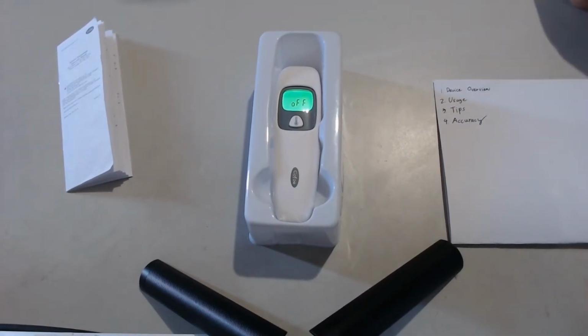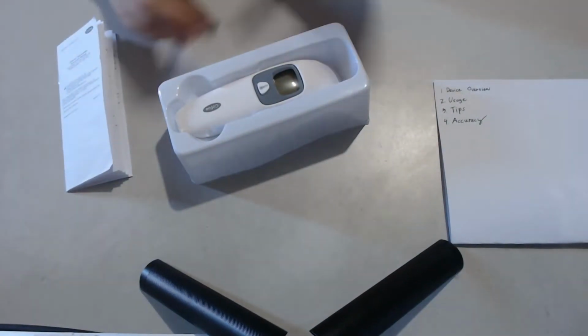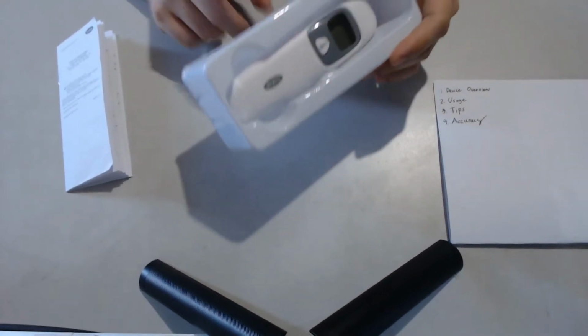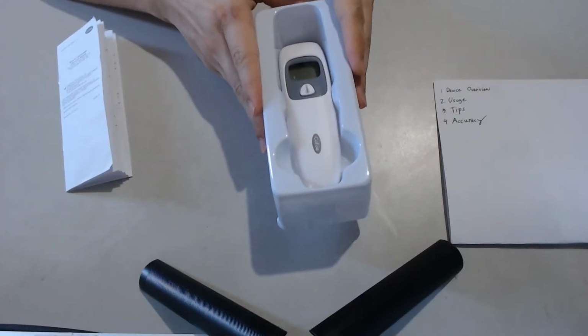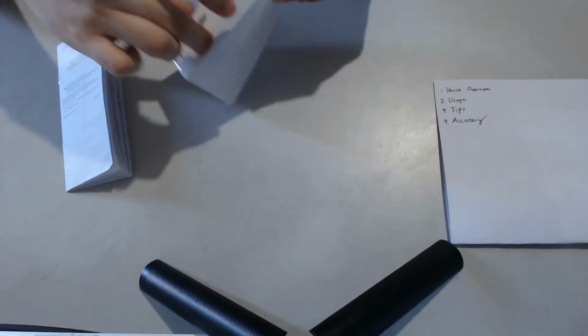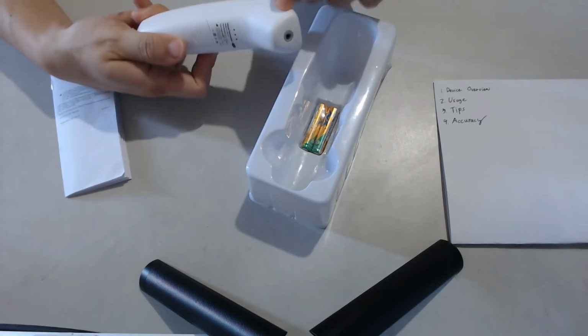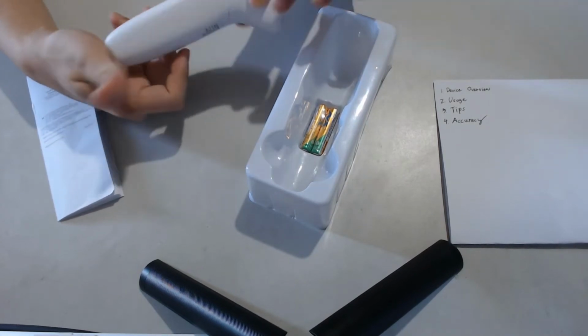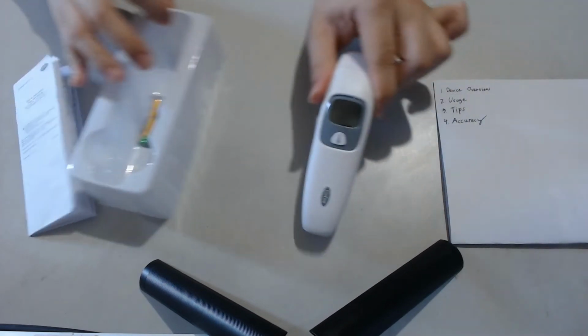So that tackles the two things: device overview and usage. Now for the tips. Tip number 1 is keep the plastic. Do not throw this away. If you're going to throw away the box, sure, go ahead. But keep this, especially if you don't have a medical box to put this in. Why? Because this one relies on infrared, so you want to keep it relatively dust-free.